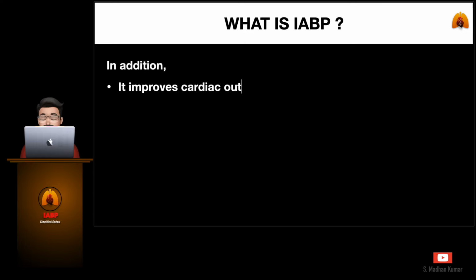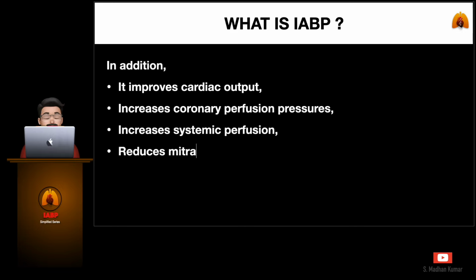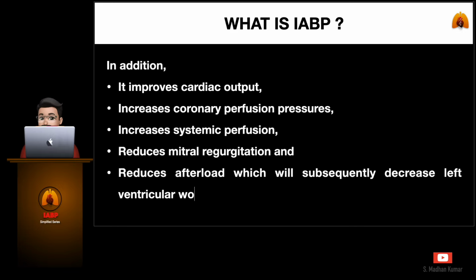In addition, it increases coronary perfusion pressure, it increases systemic perfusion, it reduces mitral regurgitation and reduces afterload, which will subsequently decrease the left ventricular workload.